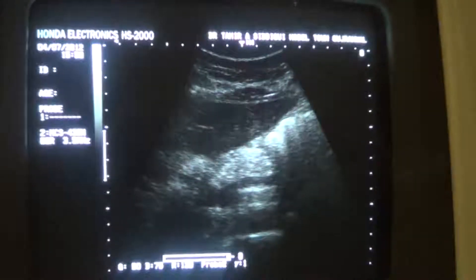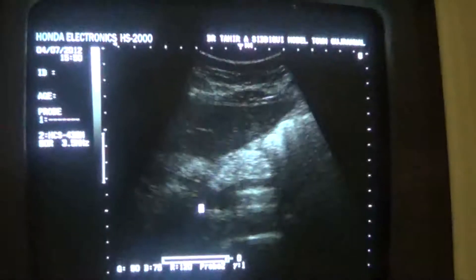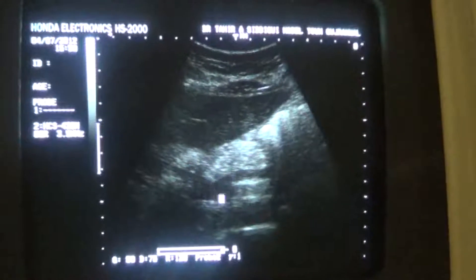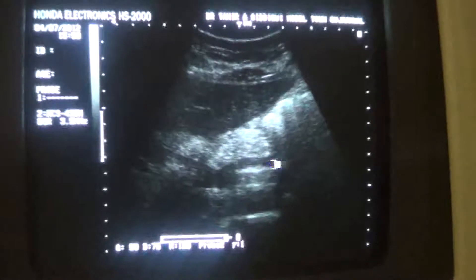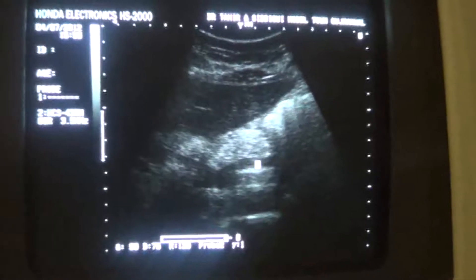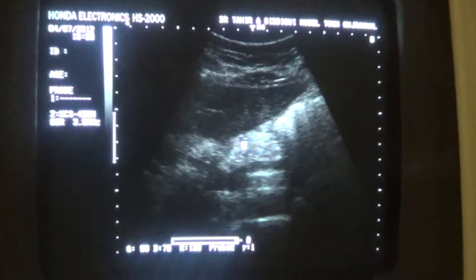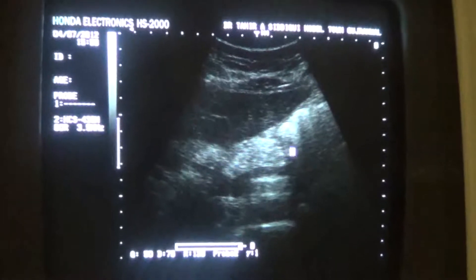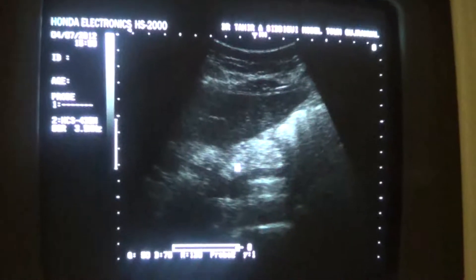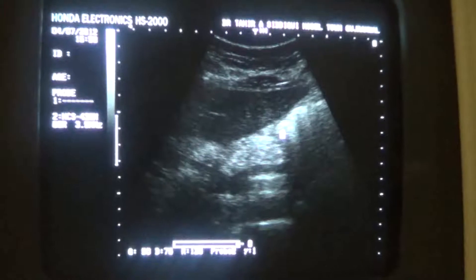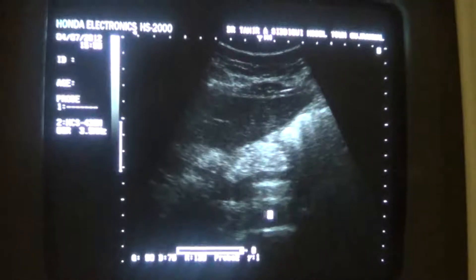In this transverse section, this is the superior mesenteric vein and this is the splenic vein — the landmark for identification of the pancreas. This is the pancreas, and this echogenic band is the body of the pancreas. These are the bowels, and this is the stomach.